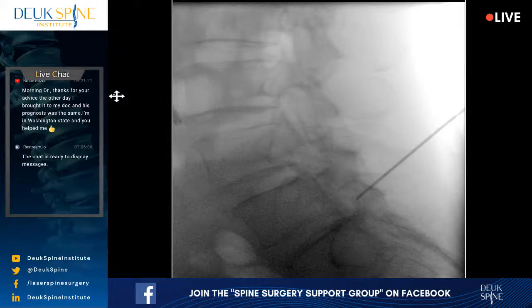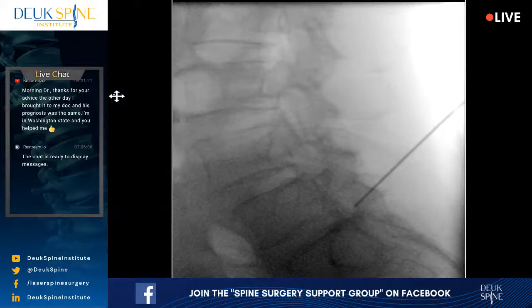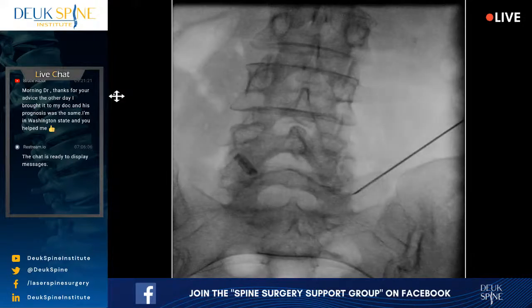Okay, you're doing great, Sean. We're really close to where we need to be. All right, let's go with an AP. So the last patient we did on Tuesday, his spine was super anterior towards the front of his belly button, towards the floor, and the angle that I had to go in was massively different. All right, that's looking better. Really good, actually. So we're right where the pedicle is of 5 and just at the lateral border of the pedicle. Let's go back to a lateral view.